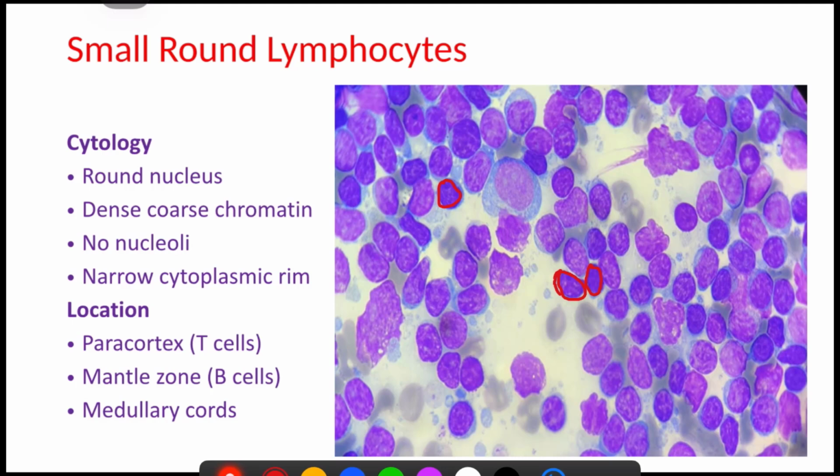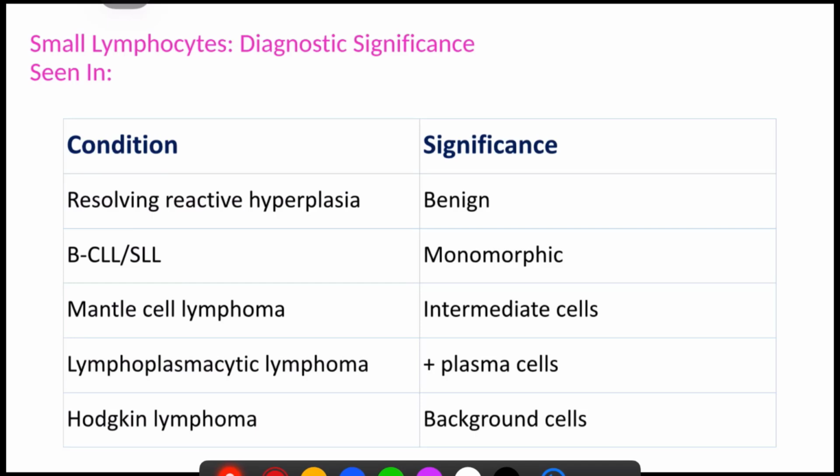Here you can compare this large cell with these small cells. This is centroblast, round regular nuclear membrane and visible three nucleoli and abundant cytoplasm. And these are the cleaved cells, large, and there is a small lymphocyte, having a cleft. So these are the centrocytes.